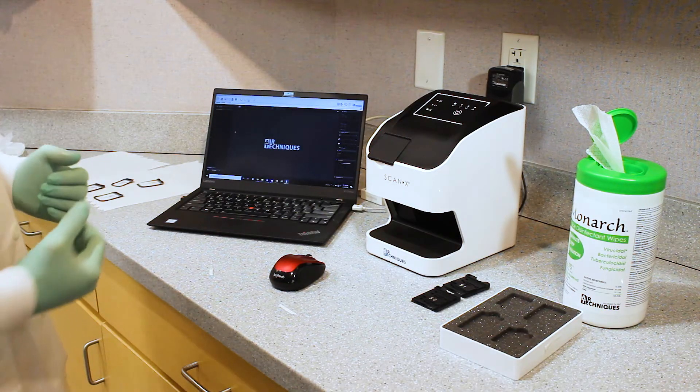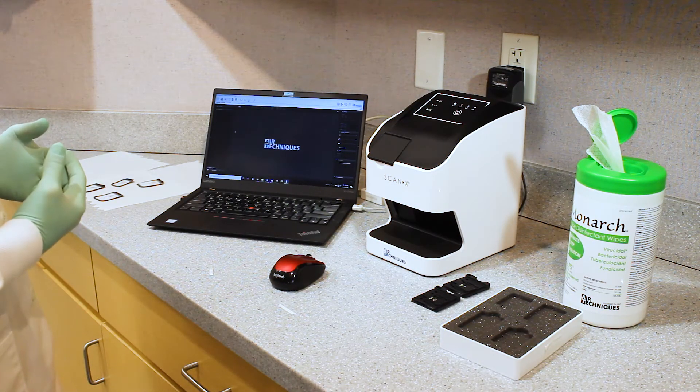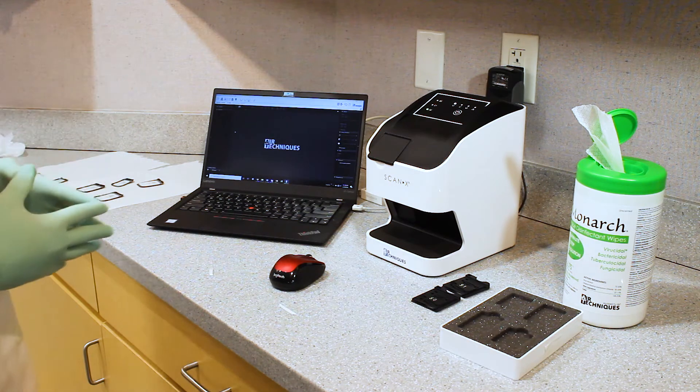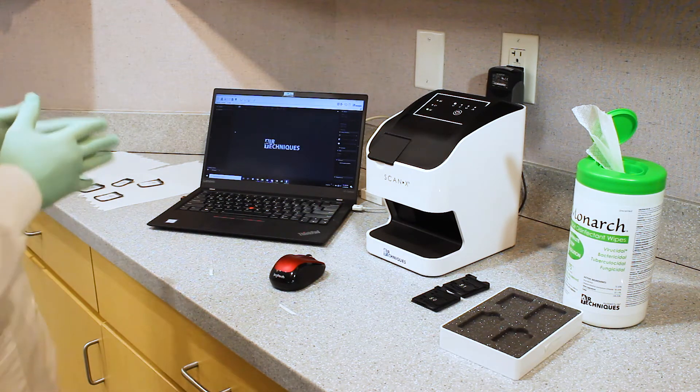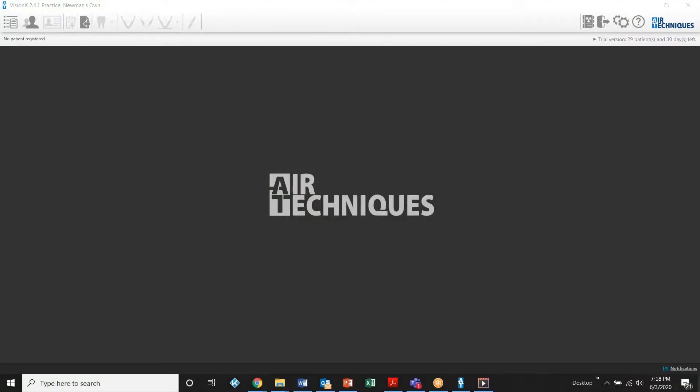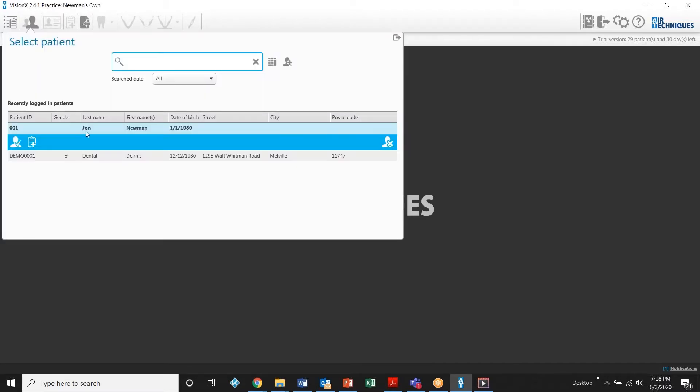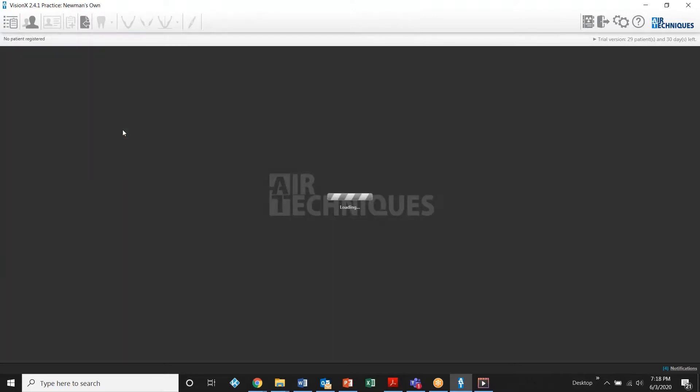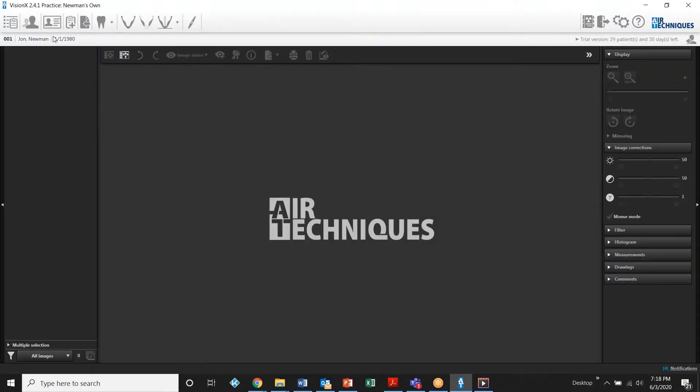The next step is going to be activating the ScanX. So we would be doing that with our imaging software called VisionX. And I'm simply going to choose my patient from the patient list. I'm going to choose myself here, John Newman. Once my patient is selected, we have the name selected up over here. This is noting which patient we are about to be acquiring into.